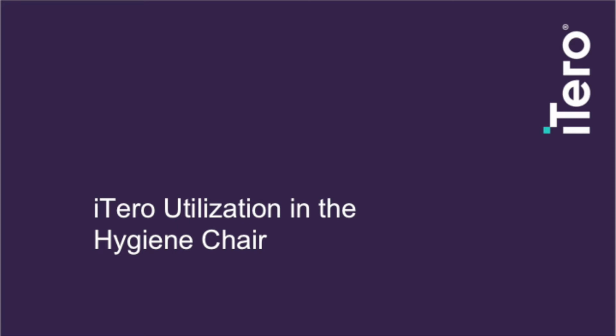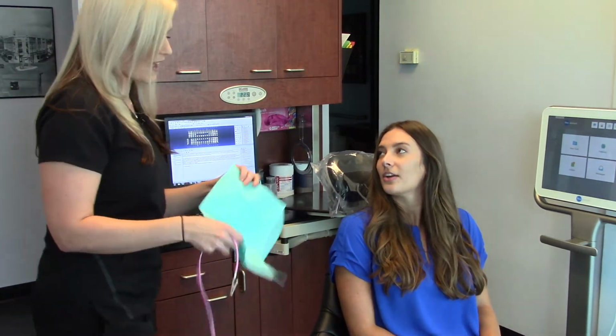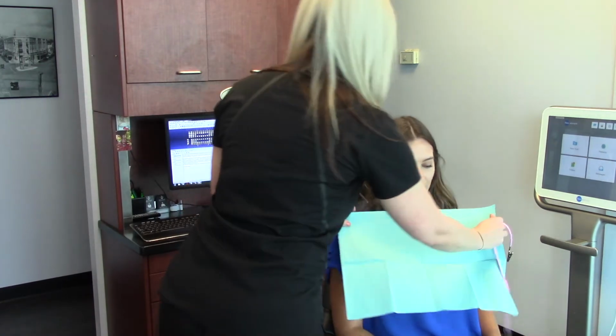Prior to initiating the scan, it is important for the dental hygienist to introduce the patient to the scanner and explain exactly what they are doing. This is also a great opportunity to brand your practice as the digital solution for your patient's dental needs.